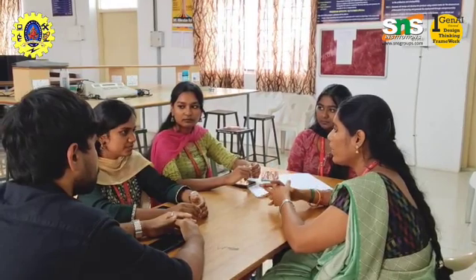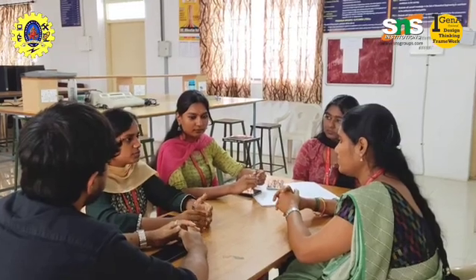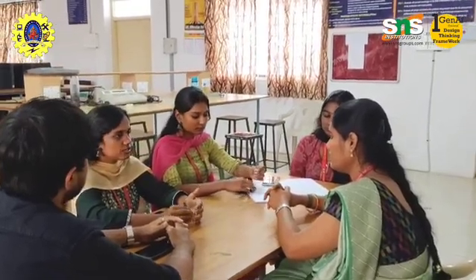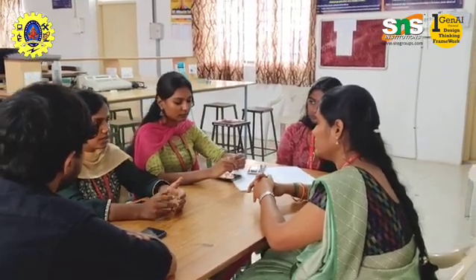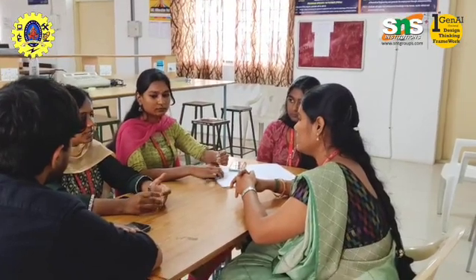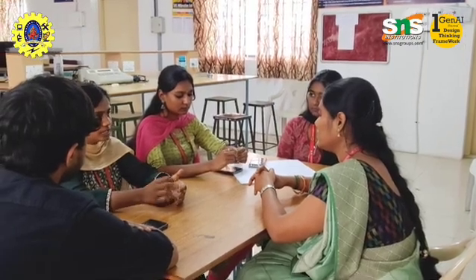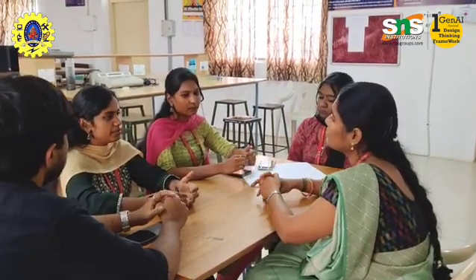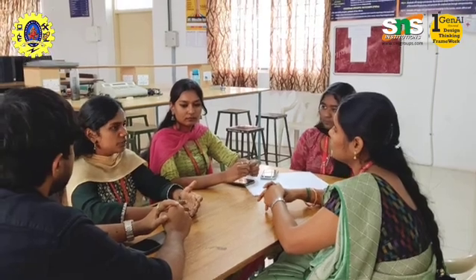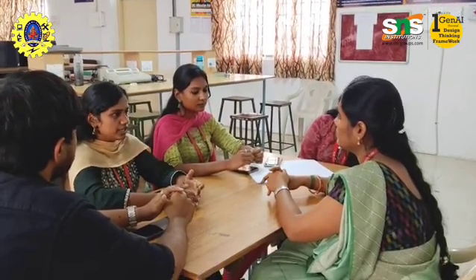Yes, ma'am, the setup and programming. Let me tell about the setup and programming. It has five steps. First is the drug preparation: morphine is diluted as per the prescription. Next is the syringe loading: the syringe is fixed into the pump holder. Third is the priming: the air is removed from the tubing. Then there are the programming parameters, which include the basal rate, PCA dose, lockout interval, and maximum dose limit. At last is the activation: the pump is started and then monitored.